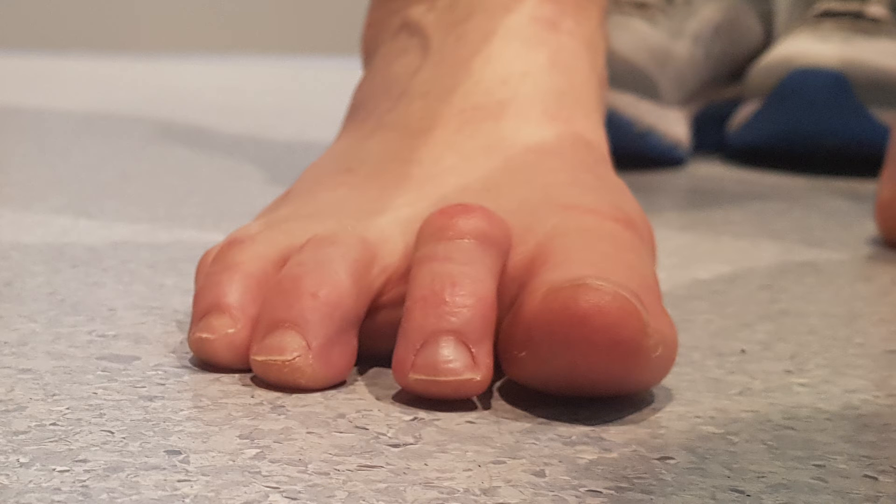Hi all, I wanted to go through one surgical method of correcting hammer toe deformity. You can see in this picture that there's involvement at the PIP joint, which is quite obvious, but also at the metatarsophalangeal joint.